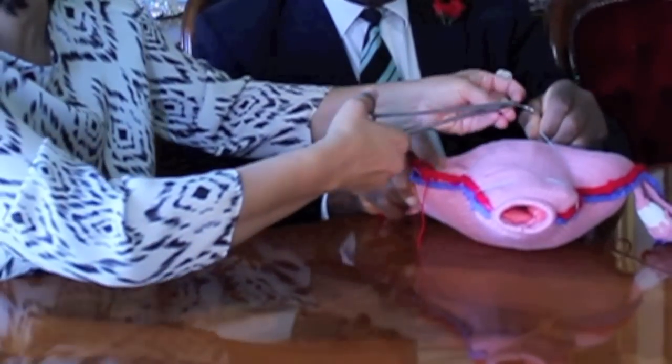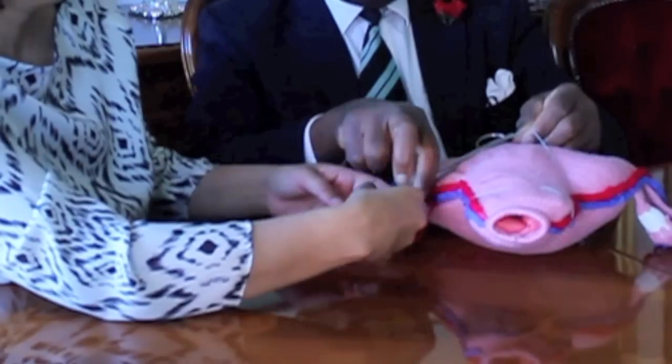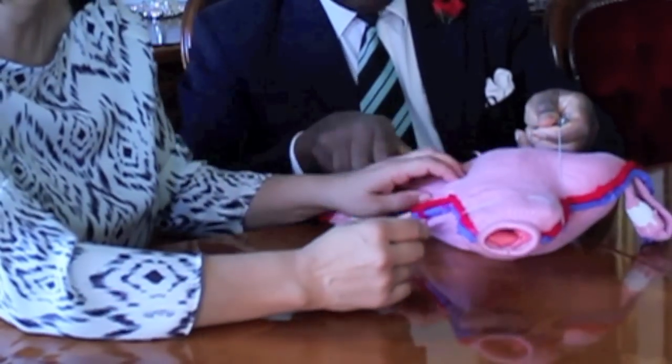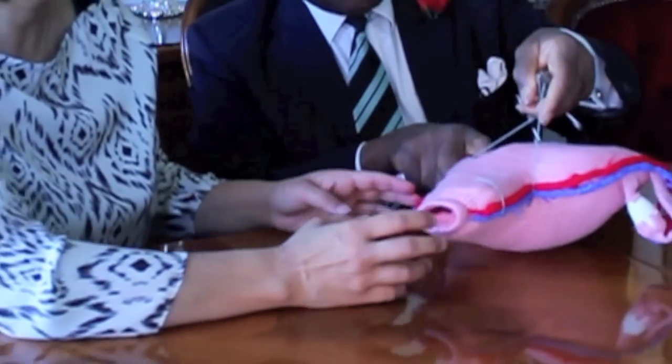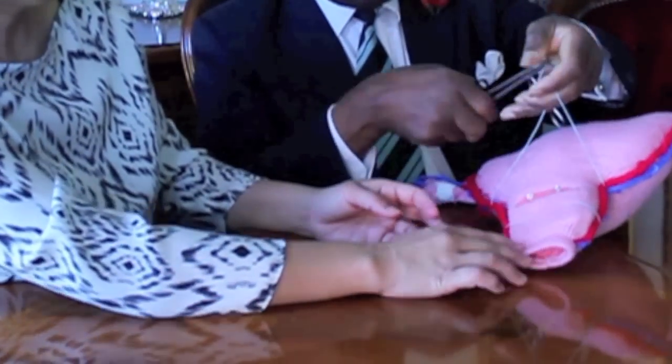Both vascular systems have been occluded by this suture technique. You will now see the two limbs of the suture surfacing as such.